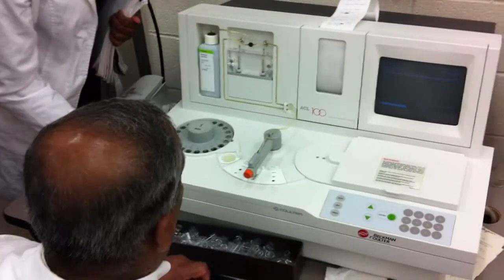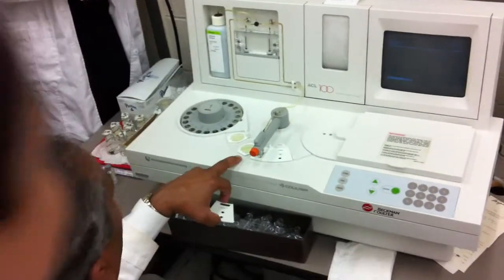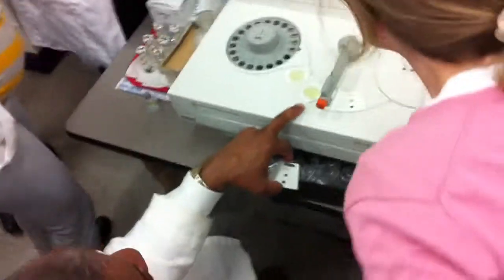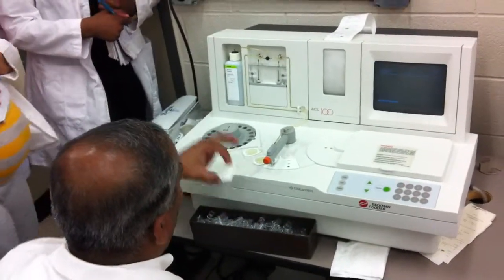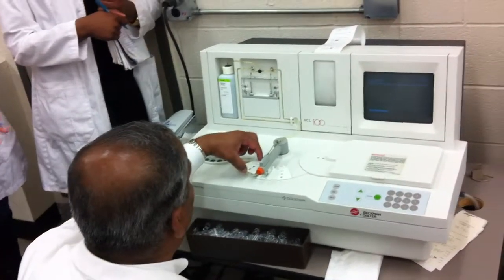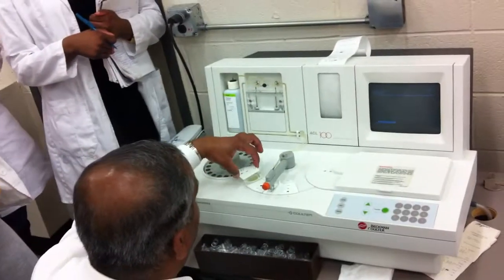Oh, Alex didn't put one. So I'm like, look at this one. Look at this one. Alex, see that? Don't lose them because it's hard. I think he has more, but don't lose them. He didn't put one in there. He's supposed to put one in there also. So you got to get him for that.